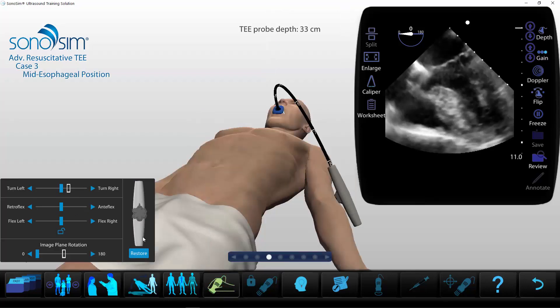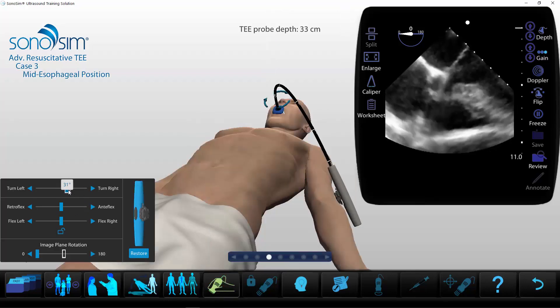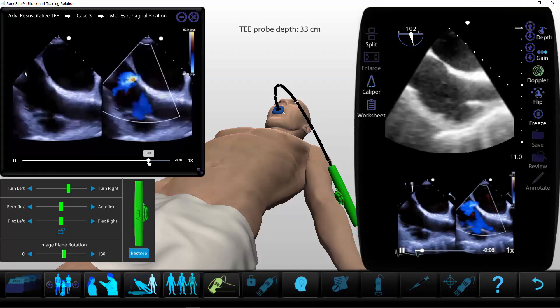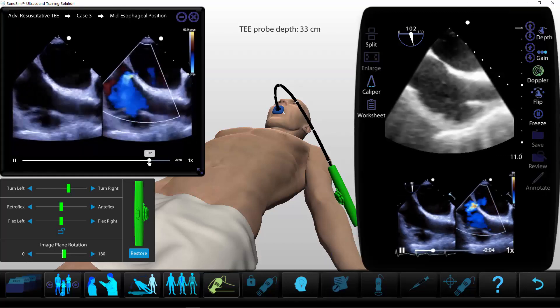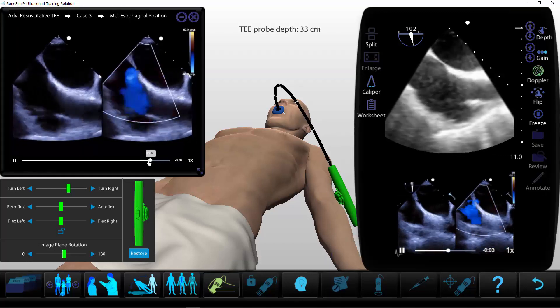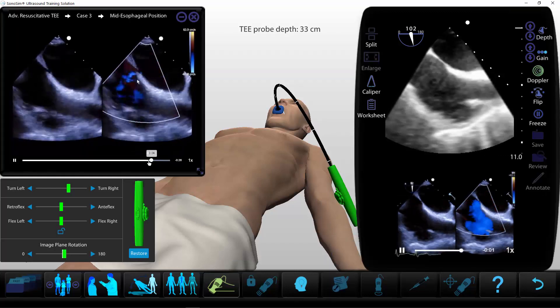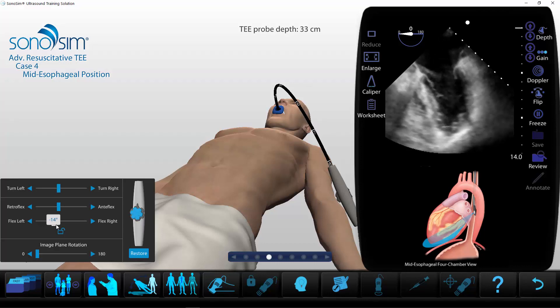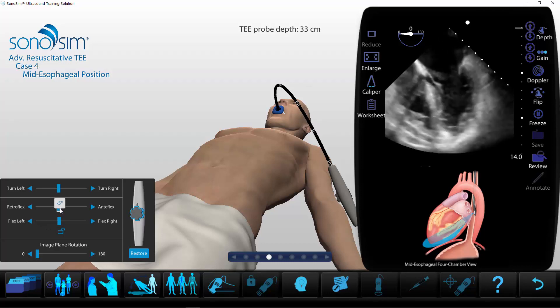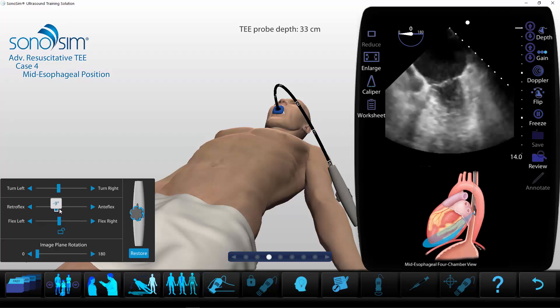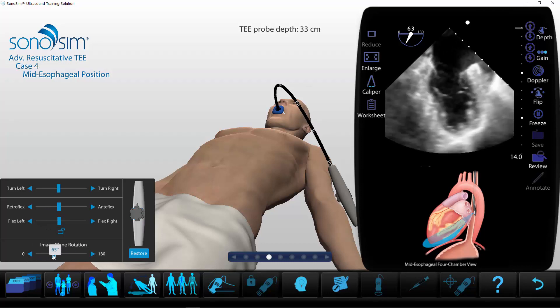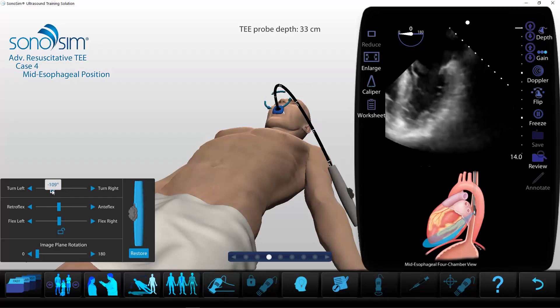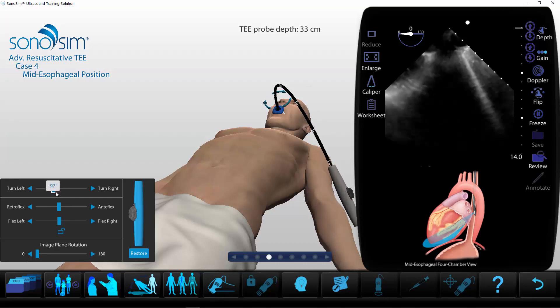Learn with Virtual Subject Matter Expert instruction for probe guidance and image interpretation. Image using Sonosimulator TEE probe tip extension, reflection, imaging transducer angle changes, and rotation controls.